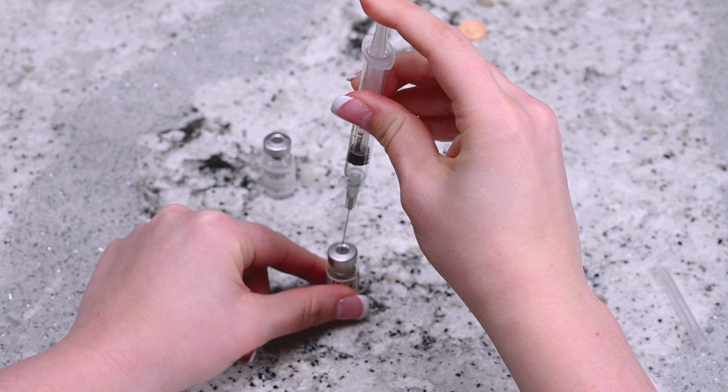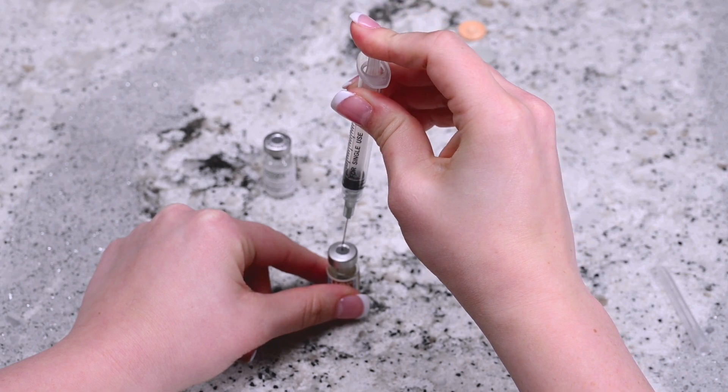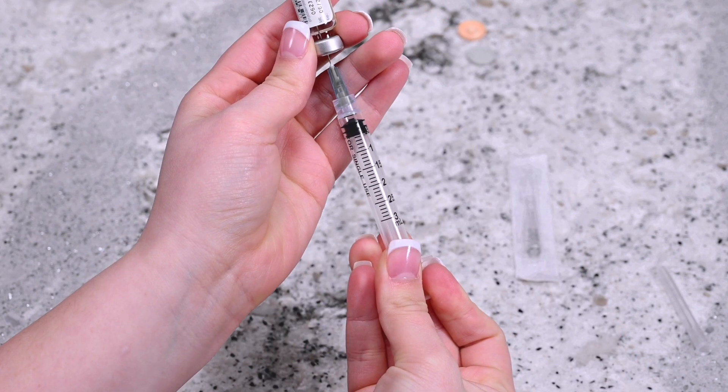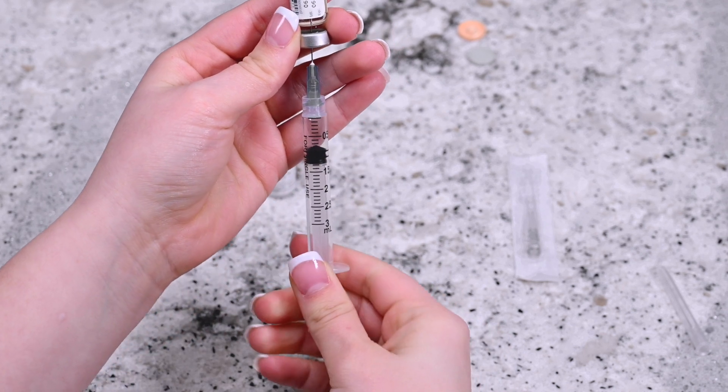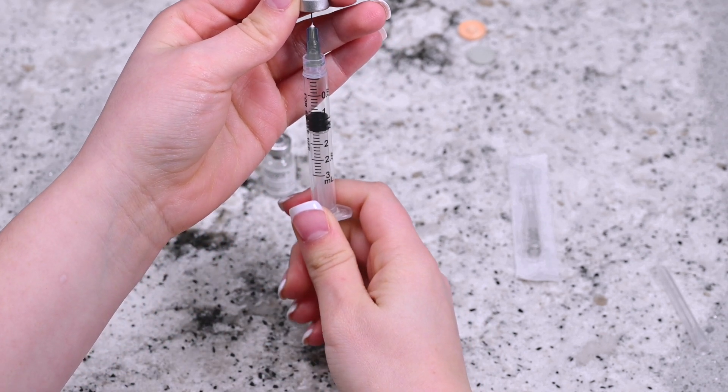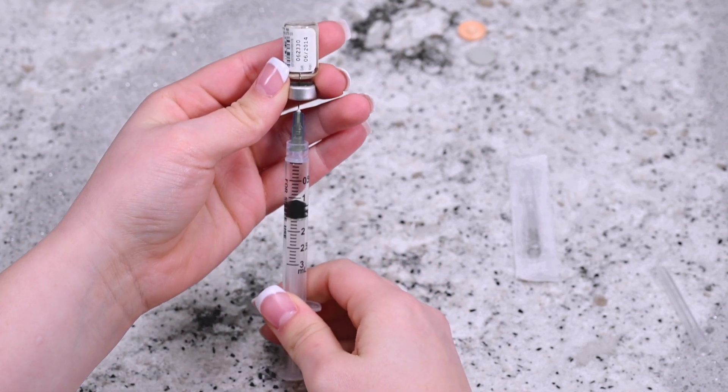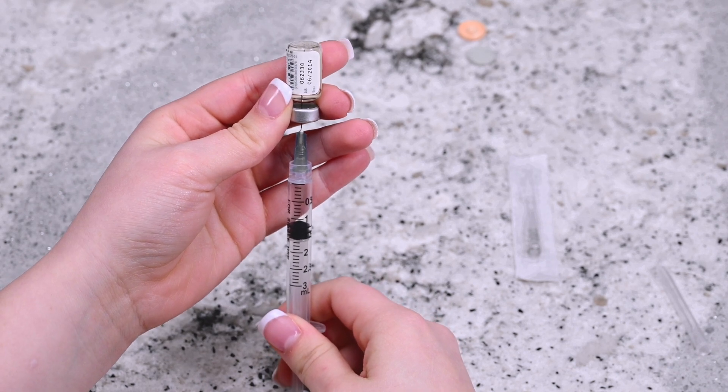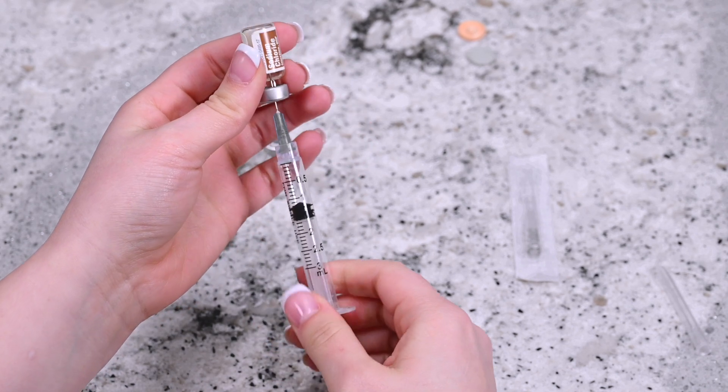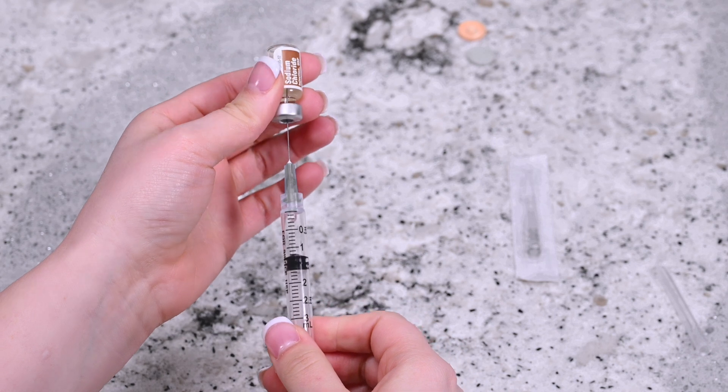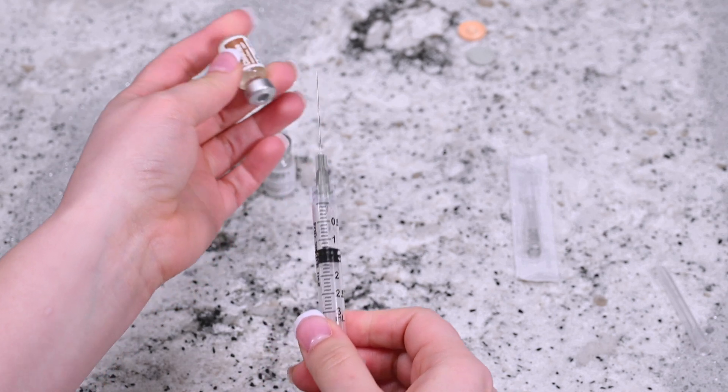Gently apply pressure onto the plunger so that the air transfers from the syringe into the diluent vial. Invert the syringe so that the vial is upside down but still attached to the syringe. Pull the plunger back slightly past the 1 ml mark. Remove the syringe from the vial and set the vial aside.